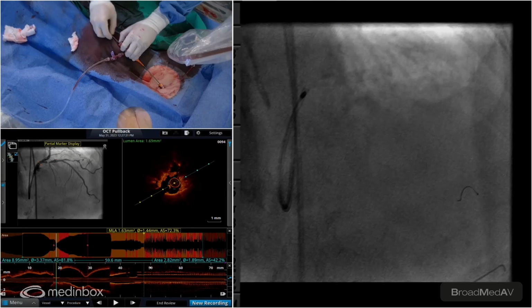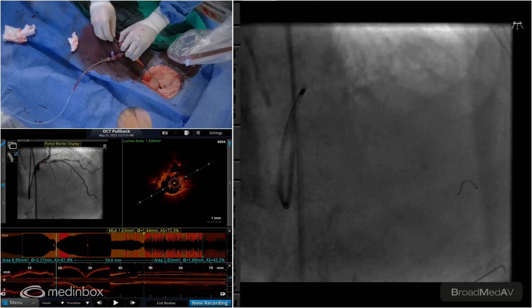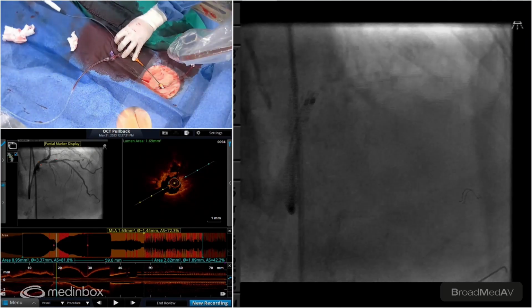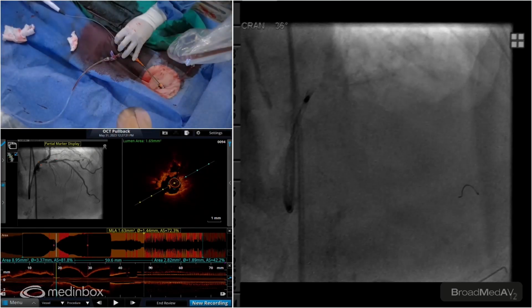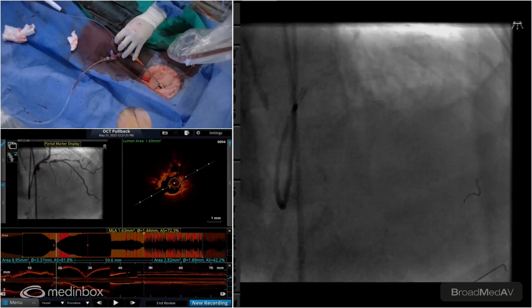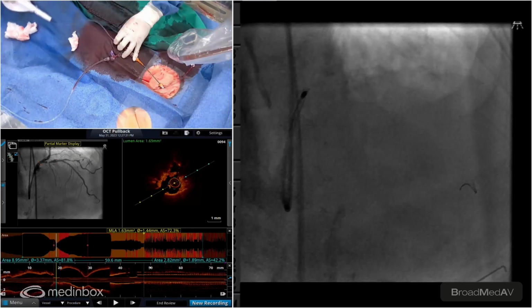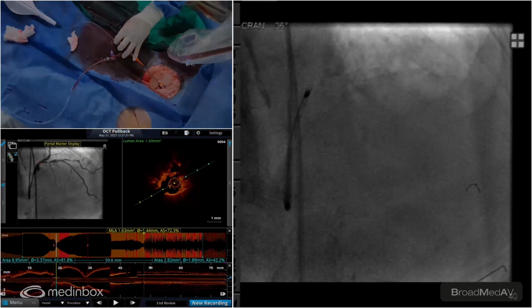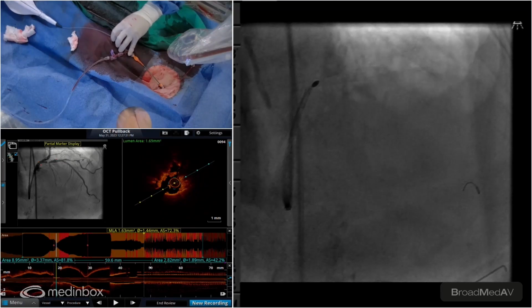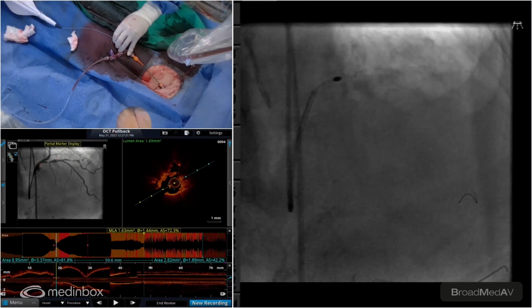I want to make sure this is mobile. And then I'm just going to do a little. Beautiful. Perfect. Oh, there you go. Get it a little bit closer. Good. You guys let me know if any D cells there. Yeah, somewhere in the 140s. We'll take our time.